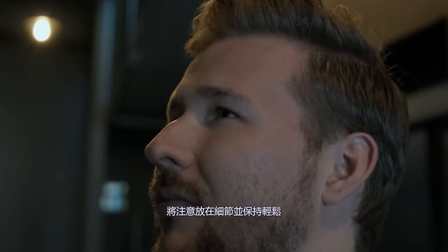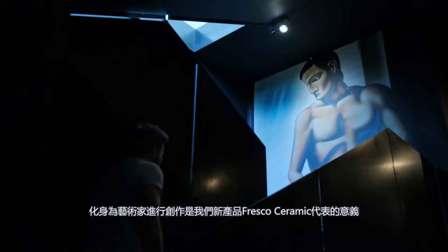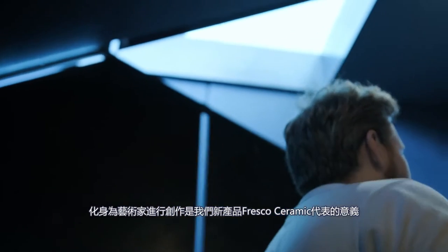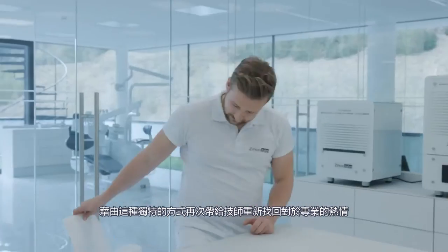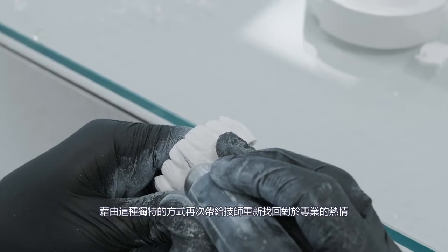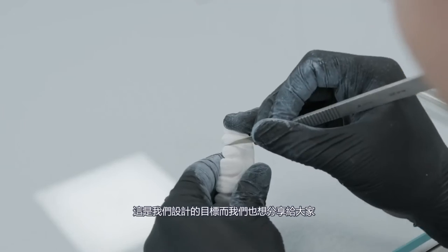Taking your time, paying attention to details, and feeling good being artistic — this is what our new Fresco Ceramics stand for in a very special way. Dental technicians can rediscover the passion for their profession. That's what makes them so special, and we want to show why.